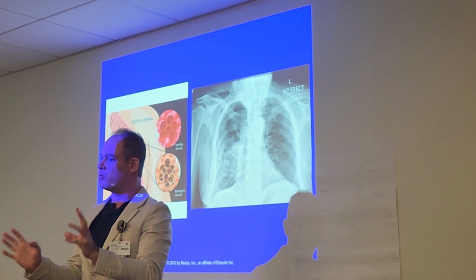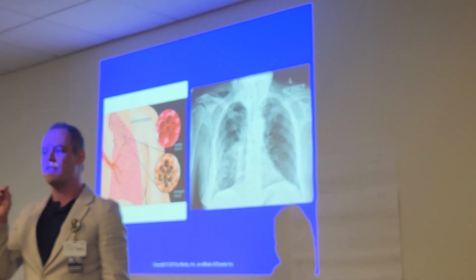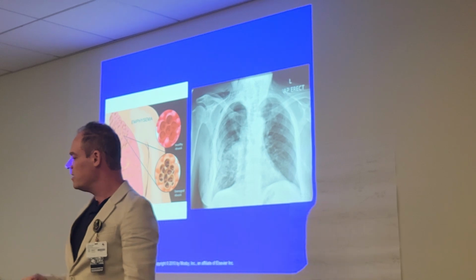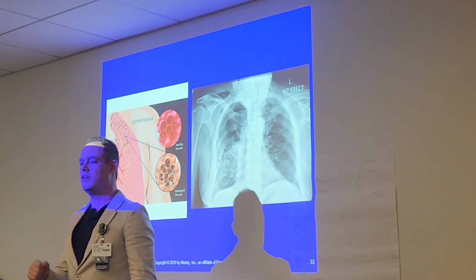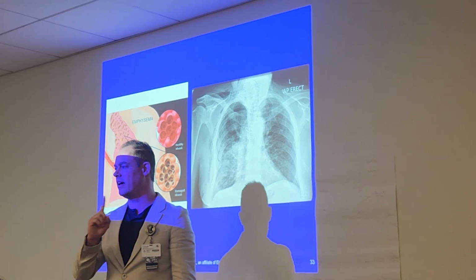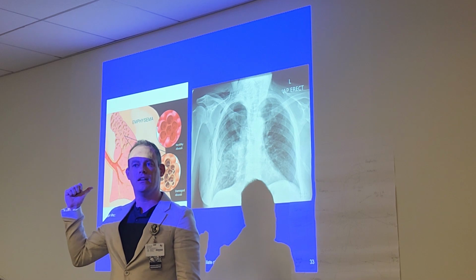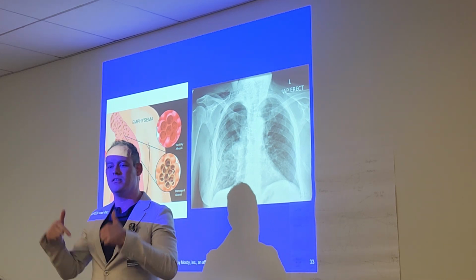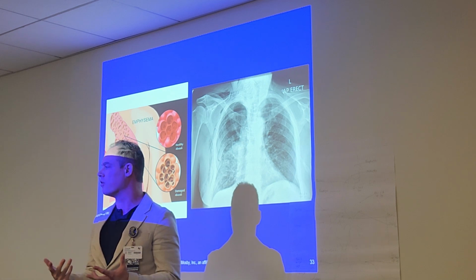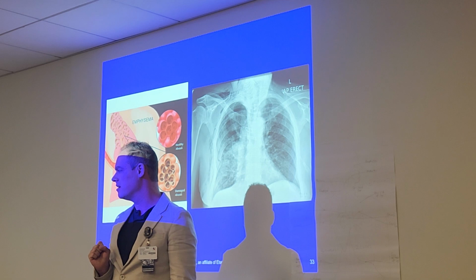So let me ask you all a situational question again, because this is directly from the registry. If a patient presents with emphysema, what do you do with your mAs to compensate? Decrease. I heard two people say decrease. Why? Because there's less tissue. Because the tissue is decaying away. Therefore, there's less lung tissue. To get a better image, I'm going to bring the mAs down because there's less to penetrate overall as the lung becomes more porous. That is directly from the registry, guys.